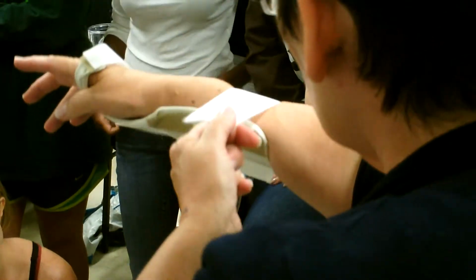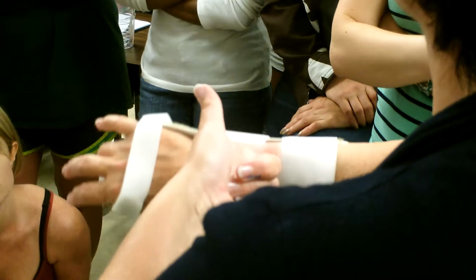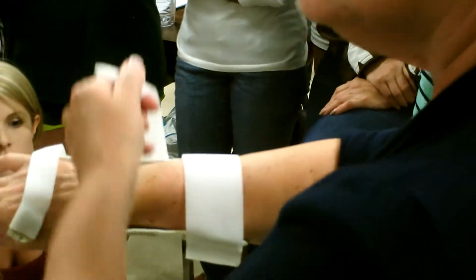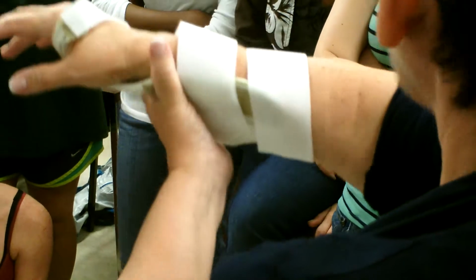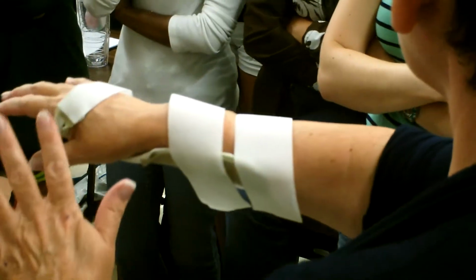But all I will tell you is don't make a strap straight across because it has a tourniquet effect and cuts off circulation. You always want to make sure that you can get a finger under a splint or else you have it too tight. You want it to be like that. I tend to do my straps diagonal, so I don't do crisscross applesauce, but I tend to do placement kind of like that and like this, and that reduces some of the friction. But if you're still getting this, you might need to go crisscross applesauce. Are we good with that?